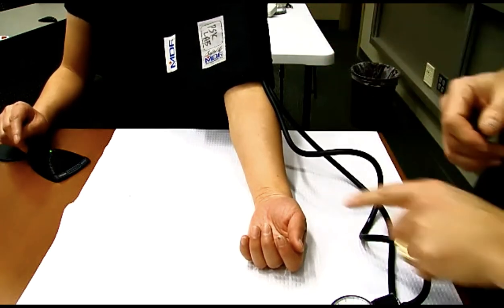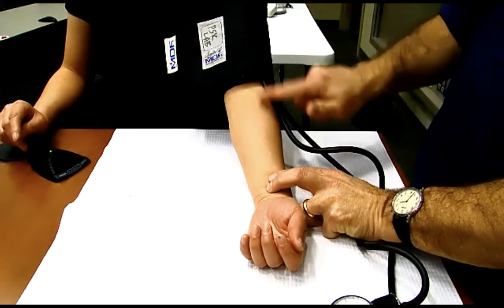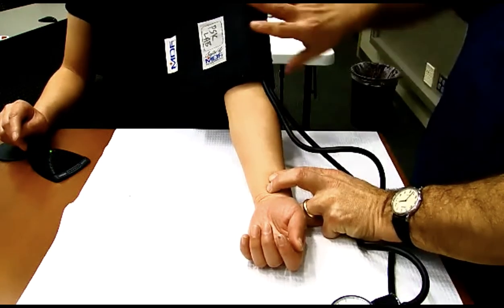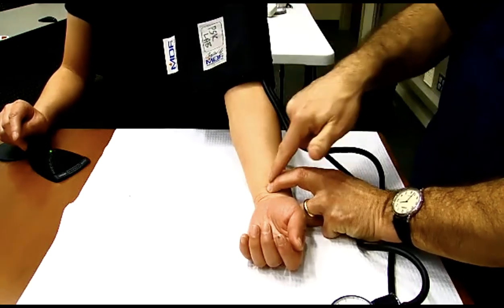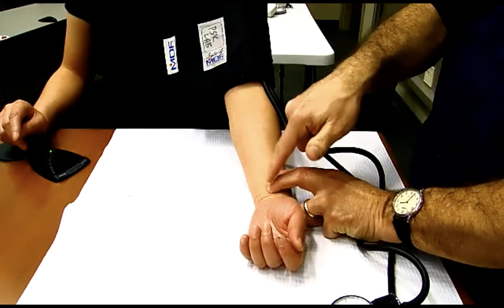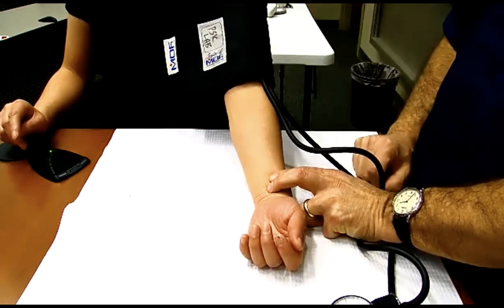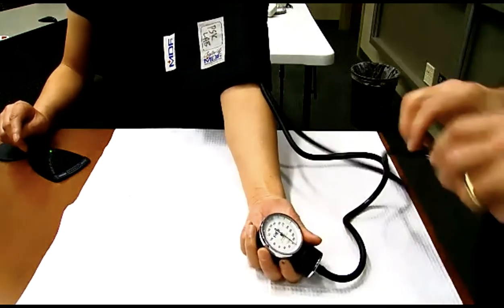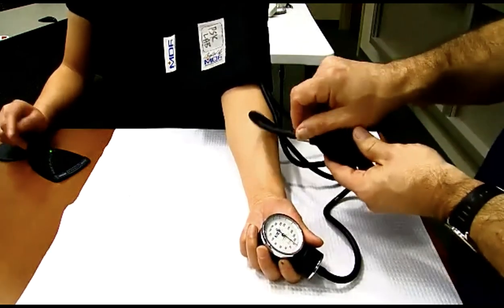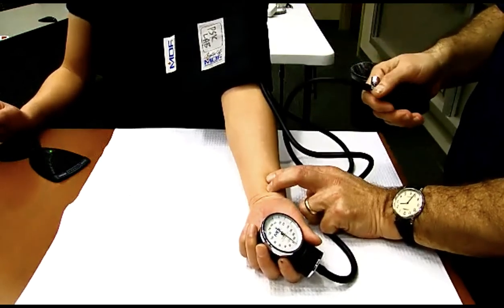So here's the deal. If I can feel her pulse here, would you agree that means that blood is flowing through her arm? But if I pump up the cuff and my pressure starts to exceed systolic, will I be able to feel the pulse anymore? No, the pulse will disappear when the blood pressure cuff equals systolic pressure. So what I'm going to do then is, you can hold that there at this point. I'm going to take my bulb valve and close it off. I'm going to feel the pulse again. Okay, I can feel it.